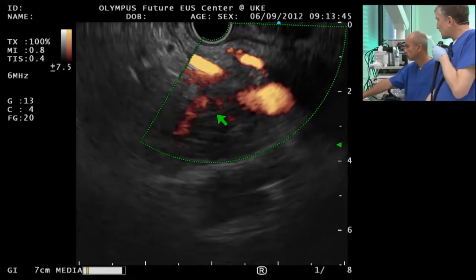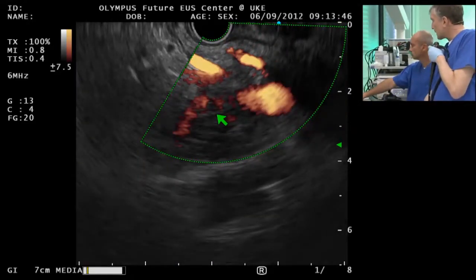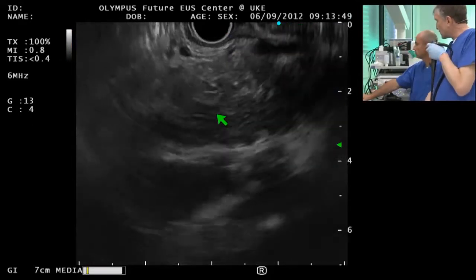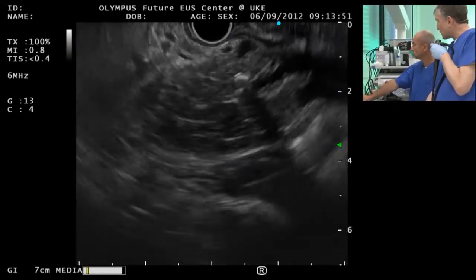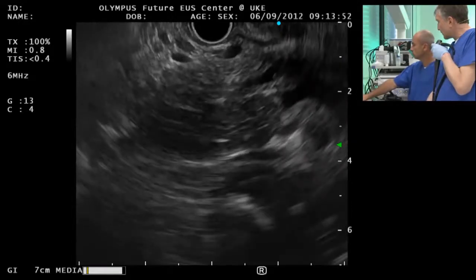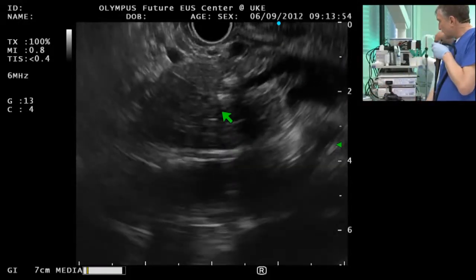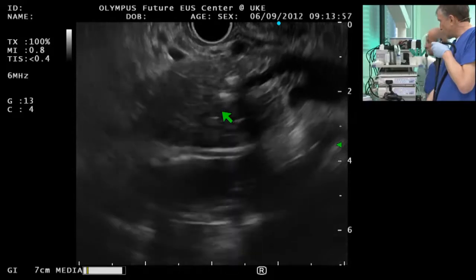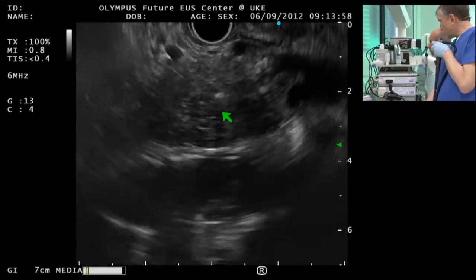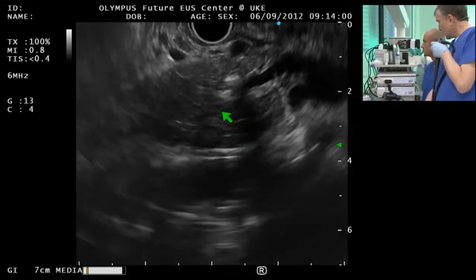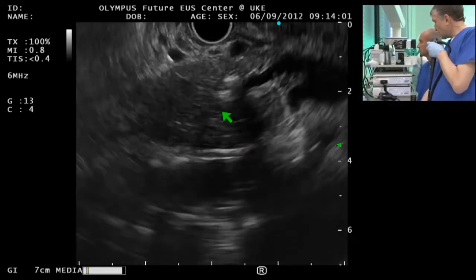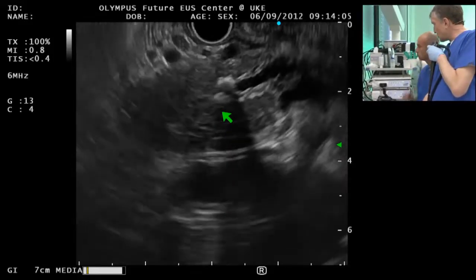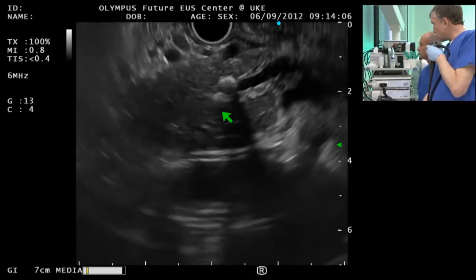So I think what's really the message is, if you have both scopes available and you don't get along with the radial, take the linear — and maybe vice versa. There are people saying that the linear scope is the better scope for the pancreas. I'm not sure, but here it clearly was.